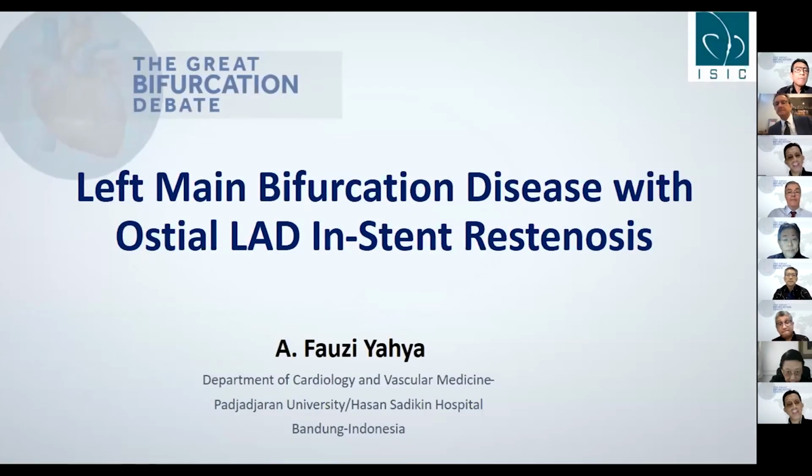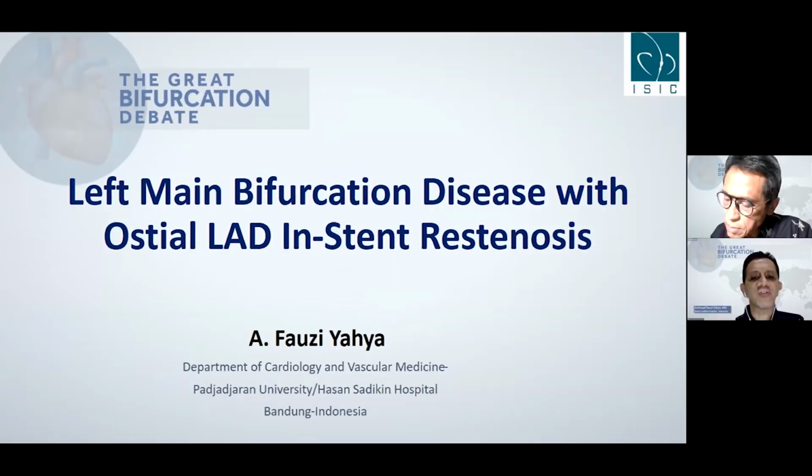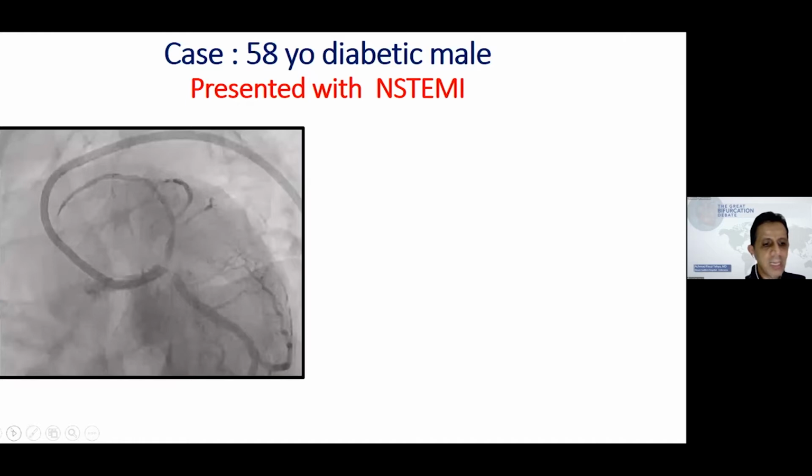Good to share a challenging left main bifurcation caused by ostial LAD stent failure. The presence of world experts in this meeting will enlighten us to discuss the appropriate strategy in dealing with these particular bifurcations. Let me start.